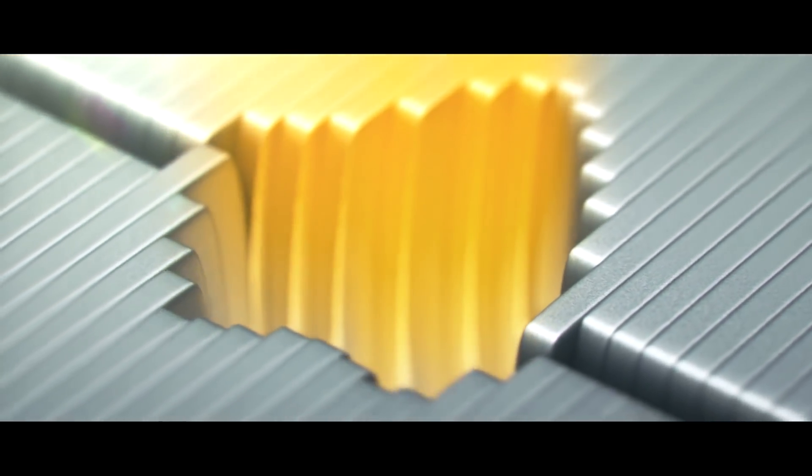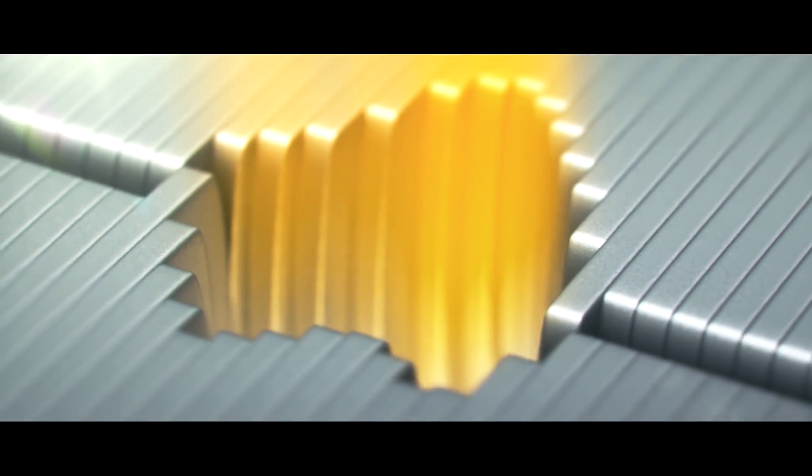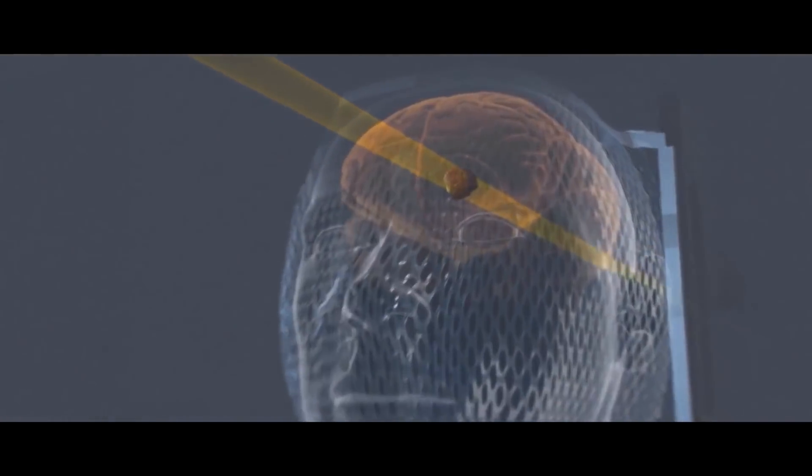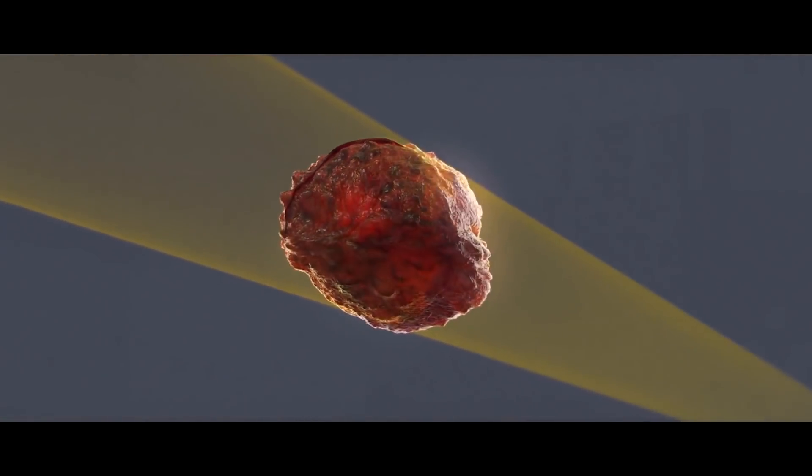What micro-multi-leaf collimators do is use multiple leaves that block part of the beam to shape the beam into the exact beam's eye view of the tumor, so the edge of the beam is exactly aligned with the edge of the tumor through that view.